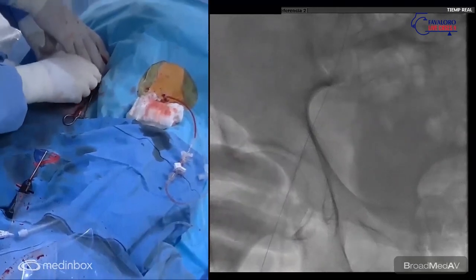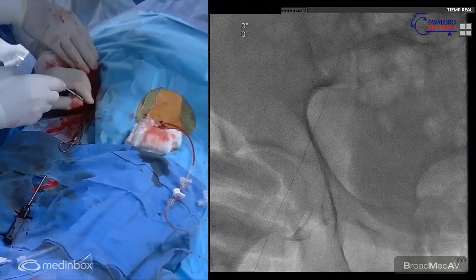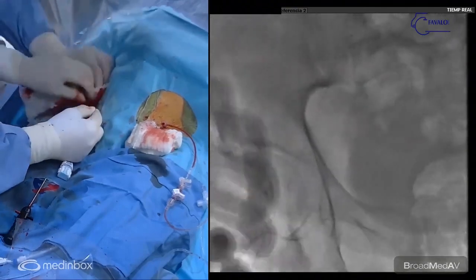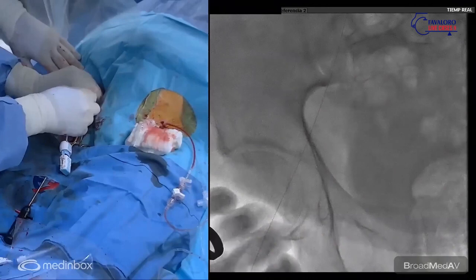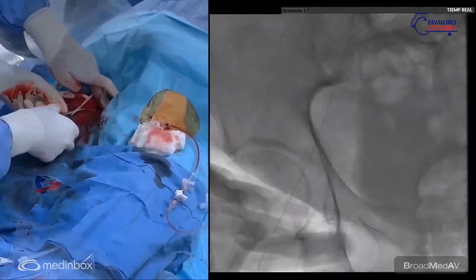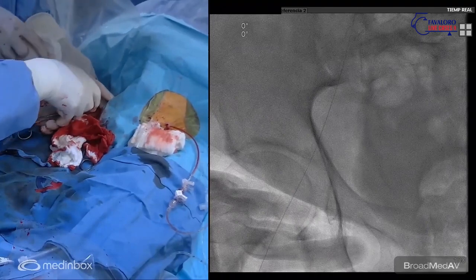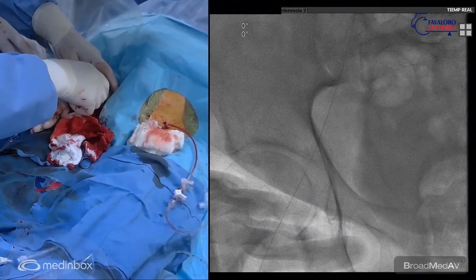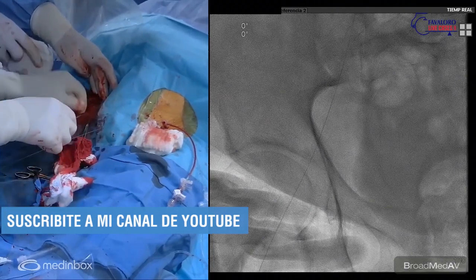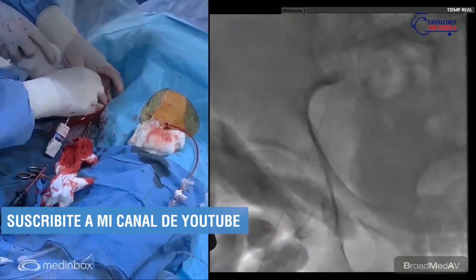It's probably the most important moment of the intervention to have a good fluoroscopic view of the valve parallel to the annulus and see the position. The rest of the intervention has become a very easy and simple procedure with a very low mortality. We have been using cerebral protection in, I would say, a third of cases. This is another point to discuss, whether we have to believe in the trials or in the experience.